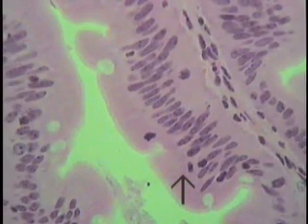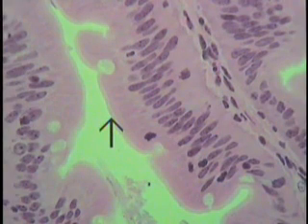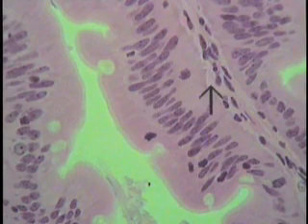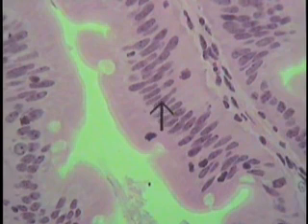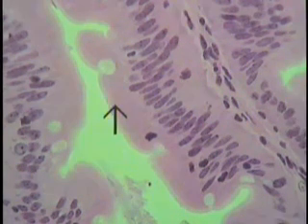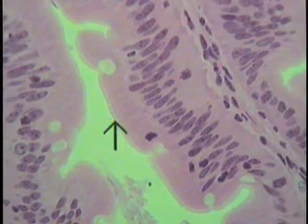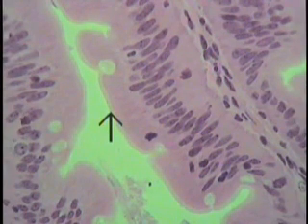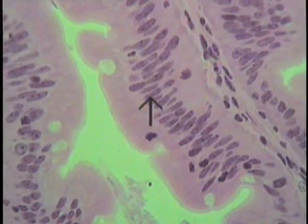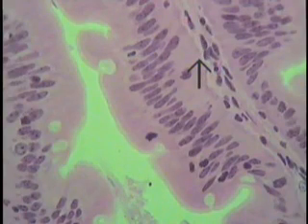I moved a little bit further along. Here we can see the epithelium, the extent of it, beginning in the lumen where the tip of the arrow is. This would be the base of the epithelium here. Here are the nuclear profiles of all the cells comprising this particular layer. If one looks very, very carefully, you can just barely make out a little light indentation, so you can see the lateral boundaries of these cells as they're closely packed together. So this cell with its microvillus border would extend to this nuclear profile, and then its base would be resting on the basement membrane at this location.